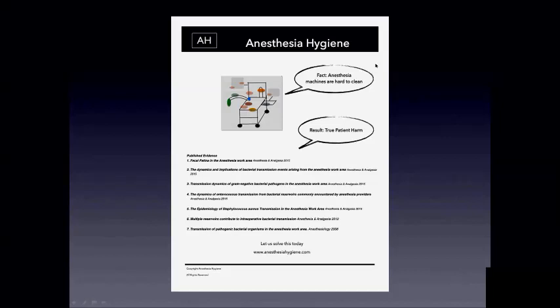So they have found, or she has specifically found, that the machine is contaminated, and not only with the regular flora or the oral secretions, it also has fecal material. It could be from the patient, from their OG or NG, or from a lot of vomiting that contaminated the provider's gloves, or it could be from the provider itself, which we don't want to mention because people don't like to hear such things from us.